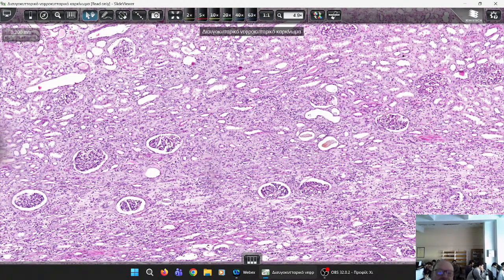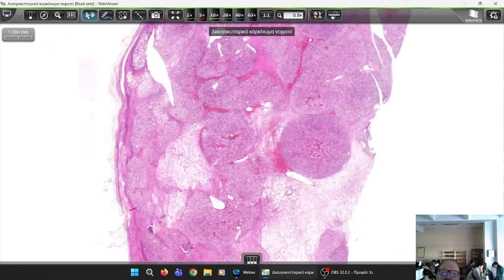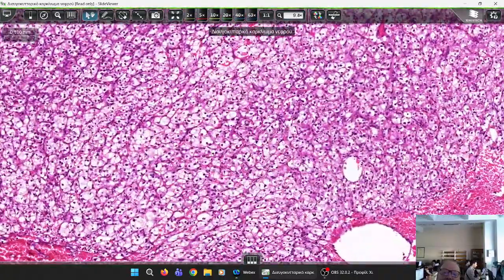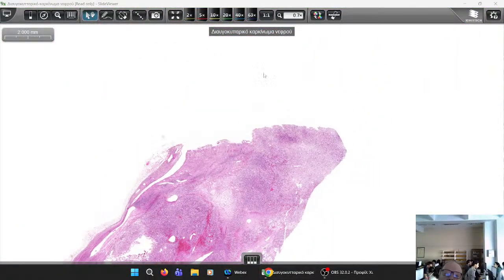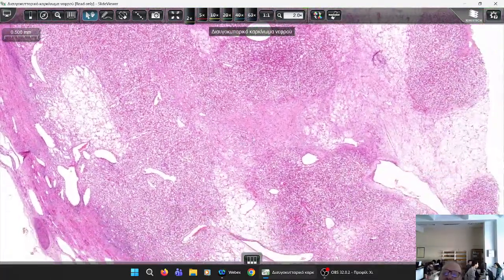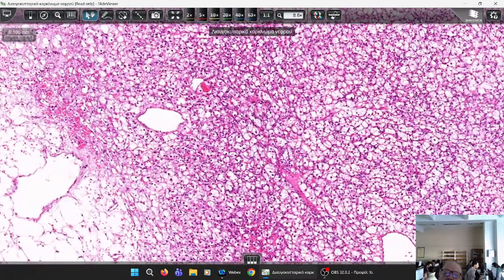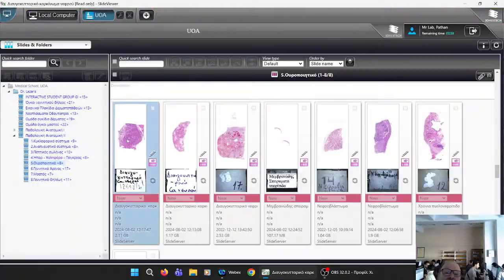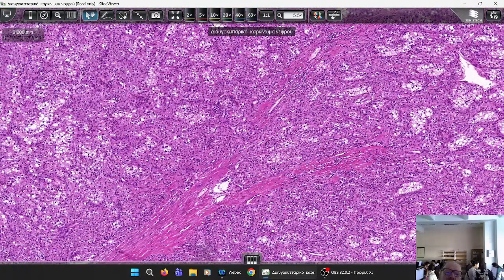And there are some other slides of renal cell carcinoma. Let's see if they are different. Yes, there is a difference here because many cells do not have... there is clear cytoplasm. Okay, there is a crystal clear cytoplasm. I'm not sure there is something different here to tell. The complete fibrovascular septa separating the groups of malignant cells. And the other one, this one, is quite different despite being a clear cell renal cell carcinoma?